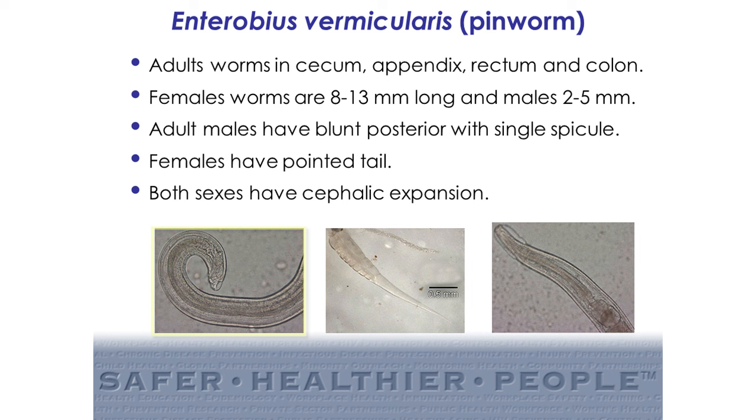The image on your left is that of a male worm with retracted spicule. In the center is a female worm with pointed tail. And the image on the right is that of either a male or a female, but here it shows the cephalic expansion that I mentioned a moment ago. It's a characteristic of pinworms.